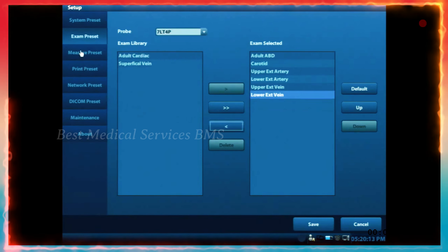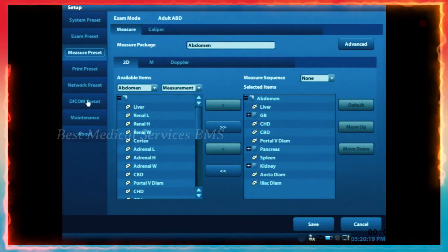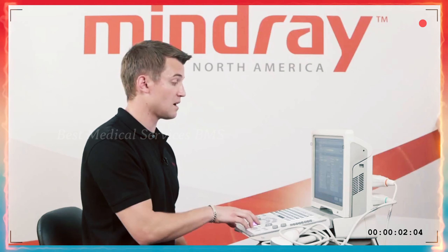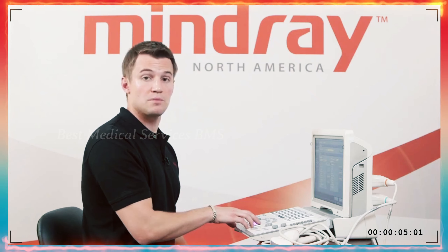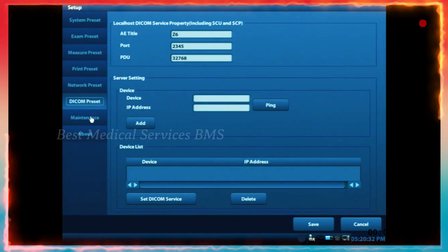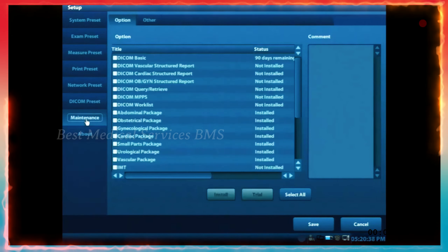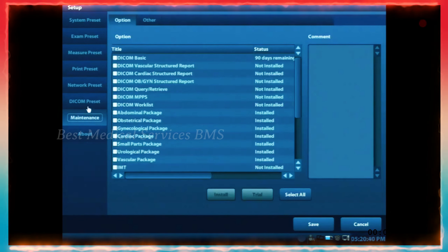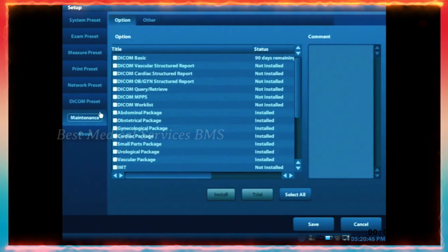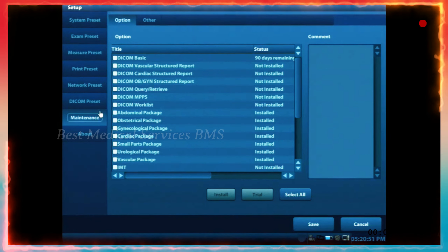Other things to look at are your measure preset, which goes along with each exam preset, as well as some networking and DICOM settings. I recommend referring to the user manual when setting up DICOM, or giving your local sales rep or clinical specialist a call. If your machine came with DICOM software, it would be on a USB thumb drive and you would install it by going to the setup screen and going to maintenance.